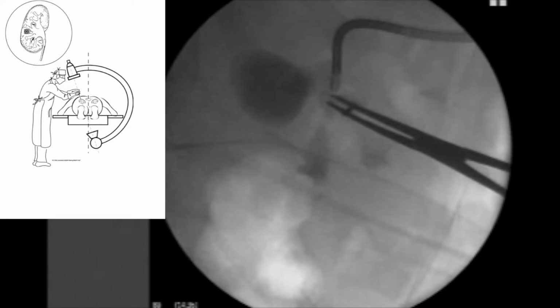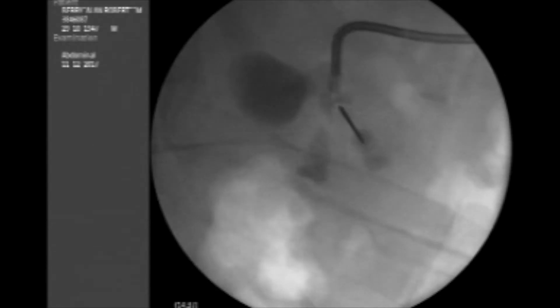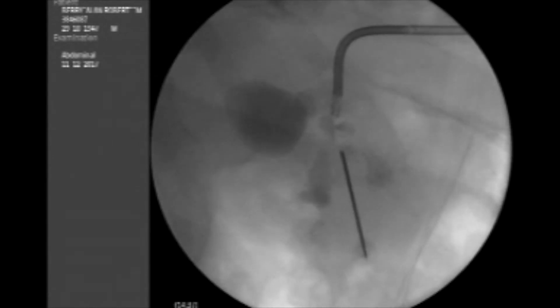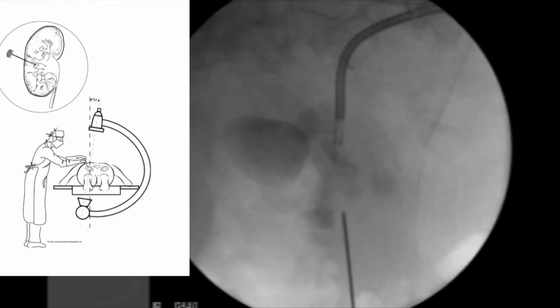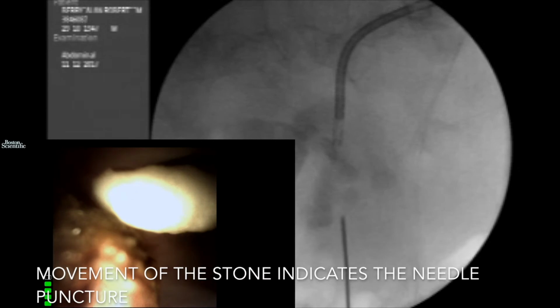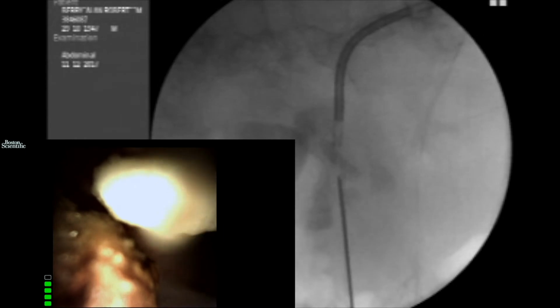So this is during the bullseye view, seeing the needle in the renal parenchyma and swinging appropriately. And then with the C-arm repositioned over to -10 across the midline, we're able to then judge depth, and then the needle was able to be advanced. So it gets in the collecting system. In this case, you can subtly see the movement of the stone where the needle enters the system. So the needle goes into the collecting system, which is denoted by the movement of the wire. Here we couldn't get the camera into the calyx due to the stone being in the way, but you can see the wire comes down through the system, out through the ureter, so we can get through-and-through access.